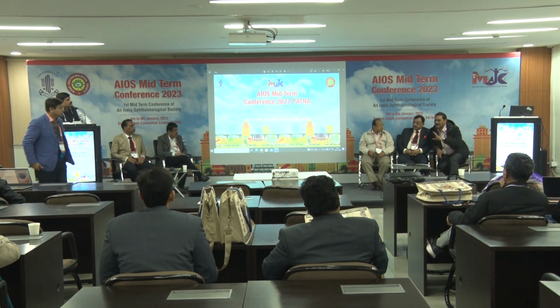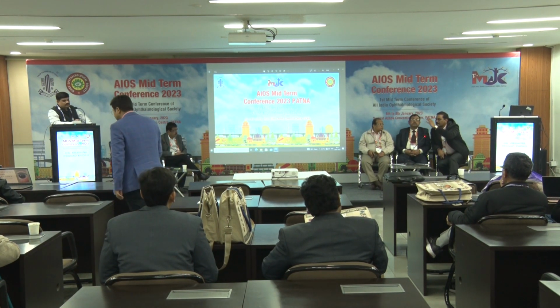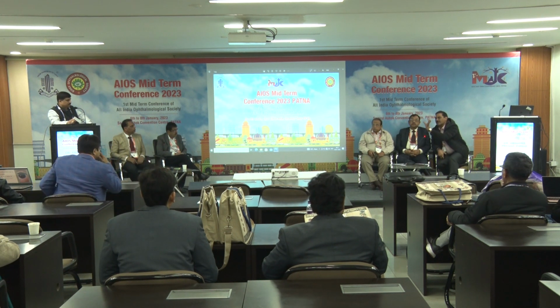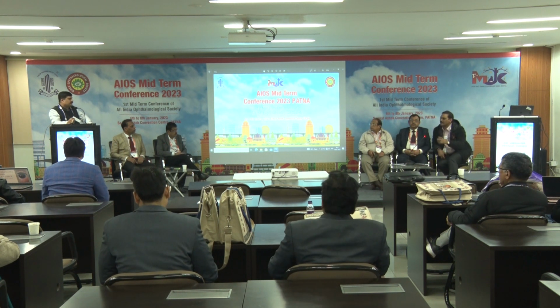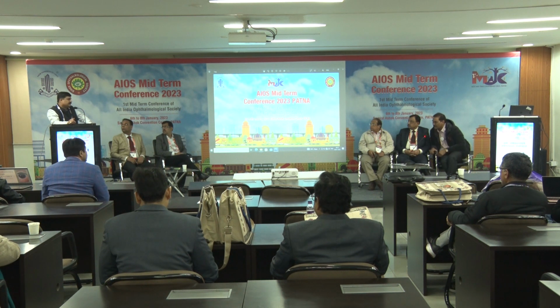So this is the problem. What happens in the IOL Master 700 is, in the intumescent cataract, it calculates the effective lens position as if the lens is much anterior. But after the surgery, the lens goes back, and the patient goes into hyperopia. That is the one thing, effective lens position, you have to also keep in mind.